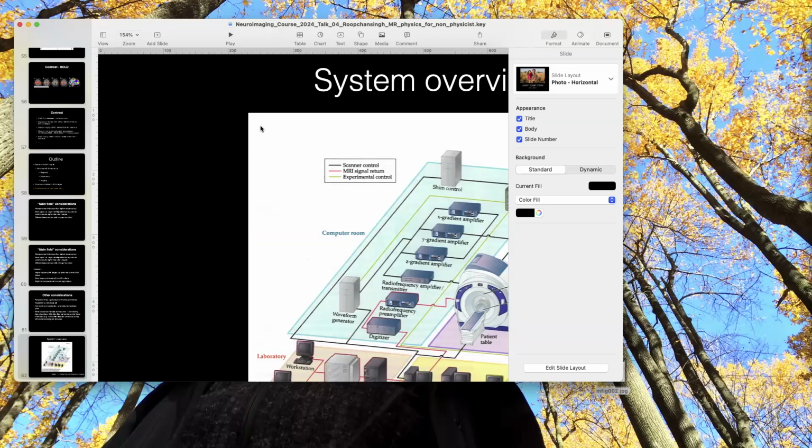I think the other part of that noise is a lot harder to deal with, because the hardware has gotten really good now. So that's actually not the majority of the problem that we have to consider now. The majority is actually in the subjects ourselves that we have to contend with. So things like breathing, heartbeats, when subjects are in the scanner their chest moves, there's pulsations of blood vessels. So all these little fluctuations and perturbations, maybe they're twitching or they're moving as they're in there.